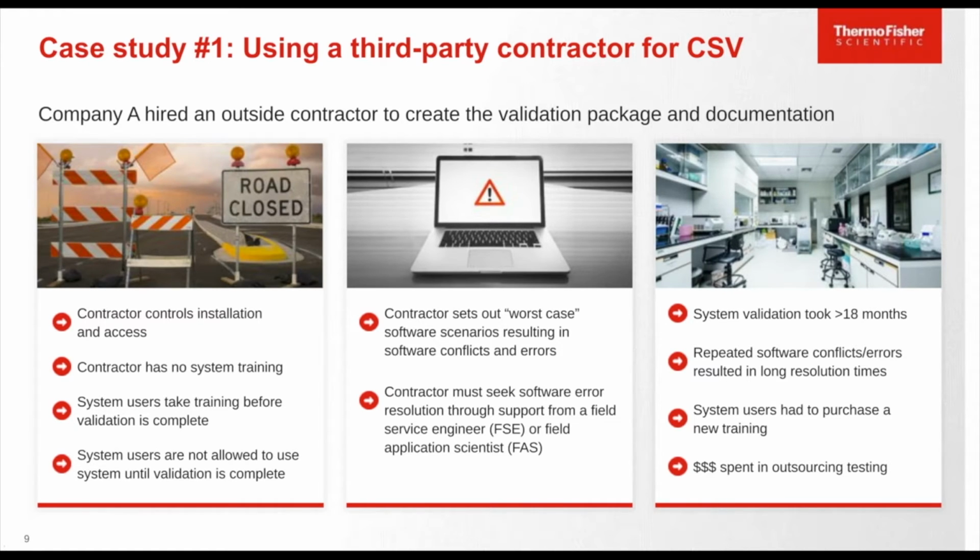But the biggest cost then to the user actually ended up being money that they spent having to outsource testing. Because it spent so long in the validation process, they actually weren't able to get their system up and running very quickly, and they had to outsource this environmental testing to others, and that cost them a lot of money. So this was the difficulty they had in working with a third-party contractor. And this wasn't unusual, not for this site and not for other sites where they implemented this particular process.